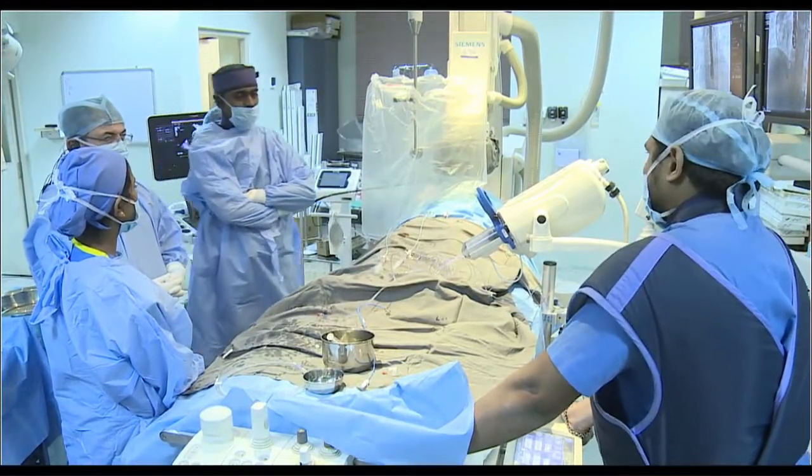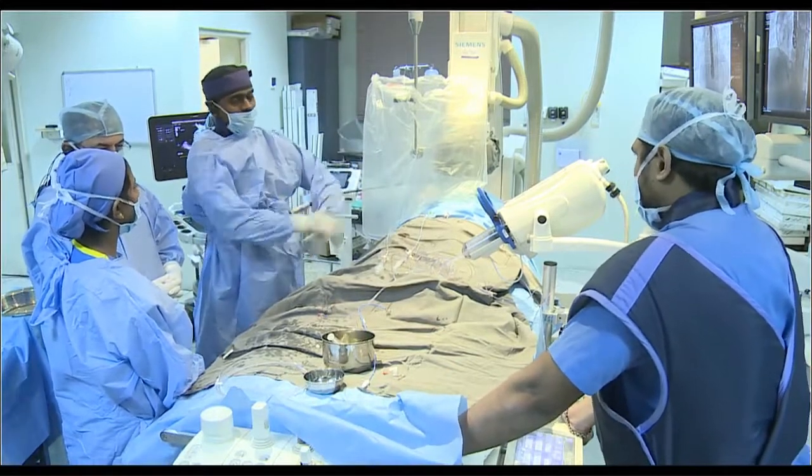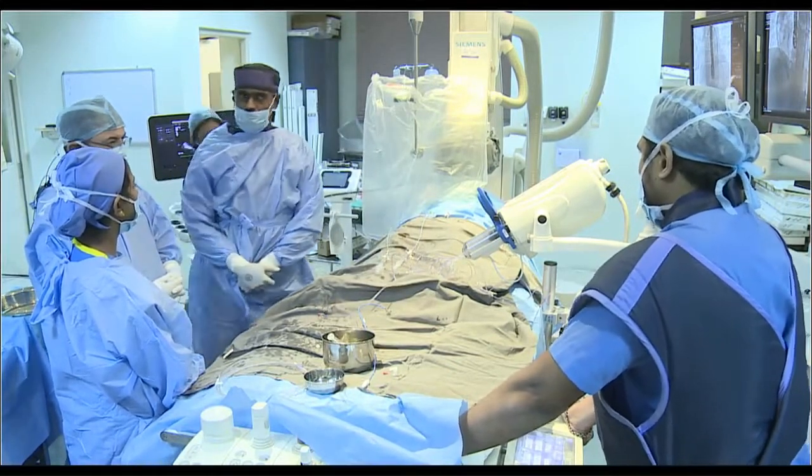We want to show a new device, the multifunction occluder. So can you quickly get on to the PowerPoint presentation, Ronak?